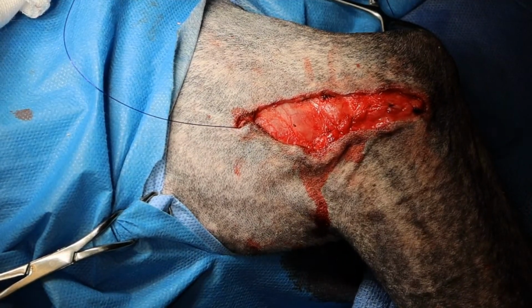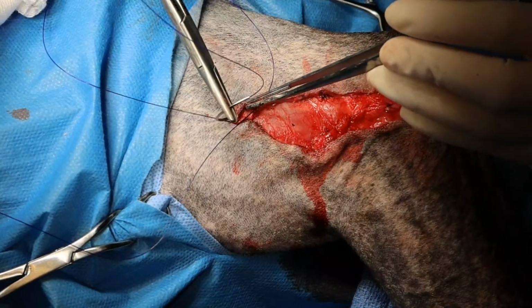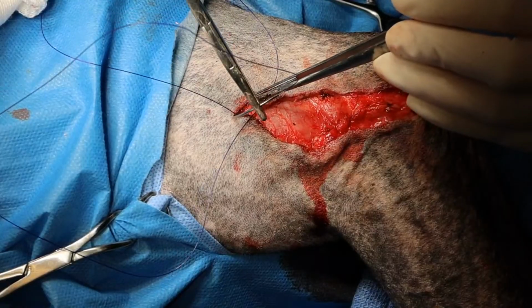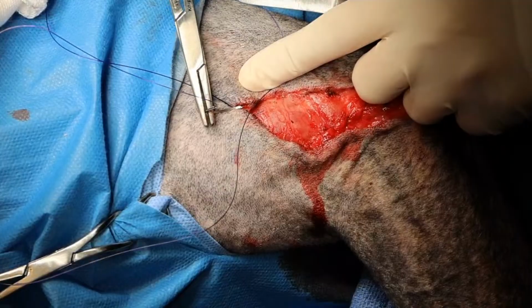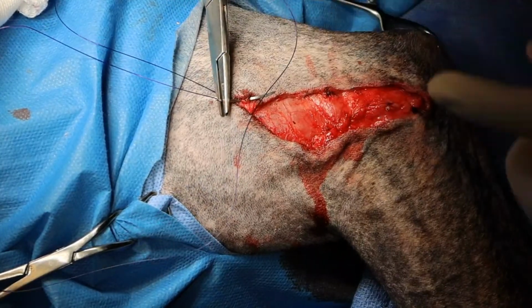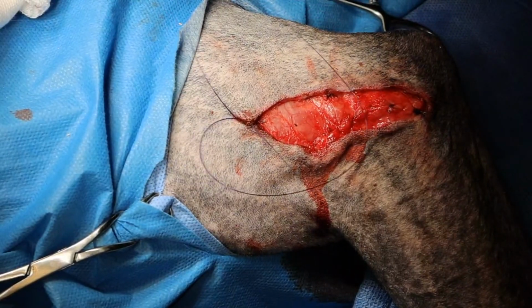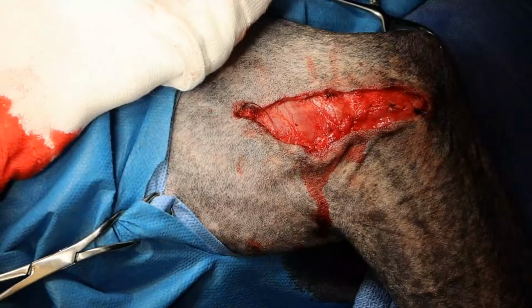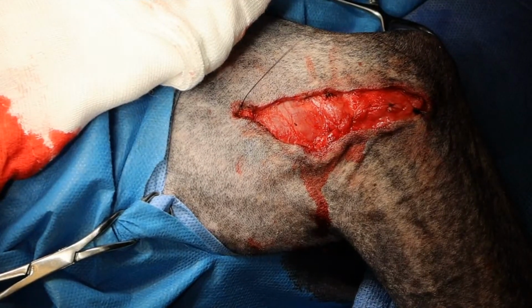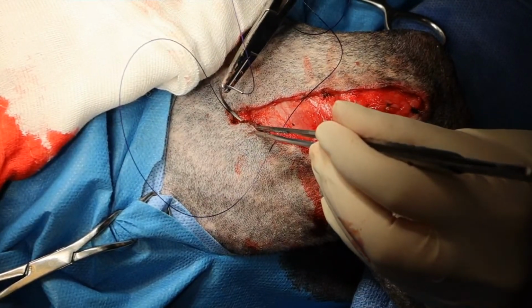And it's hard for me to show the x-ray during the surgery, but I did a video just before this. So if you look at the live stream on VetDojo, where I go through the preoperative planning, regarding periosteal proliferation, I'm not concerned. All that tells me is that that was unstable, and so we definitely needed to repair this. So I think that's pretty much it.